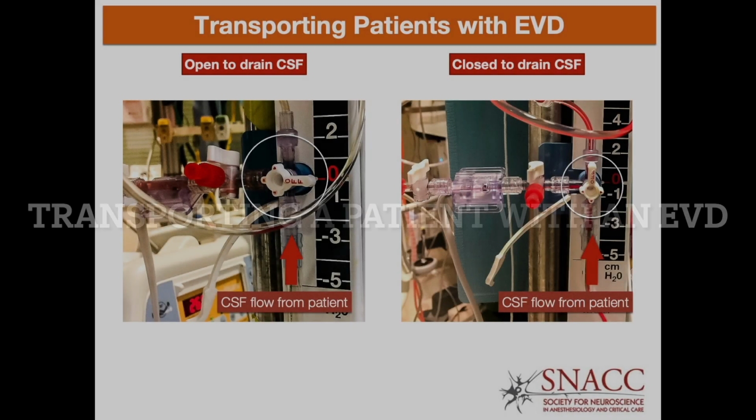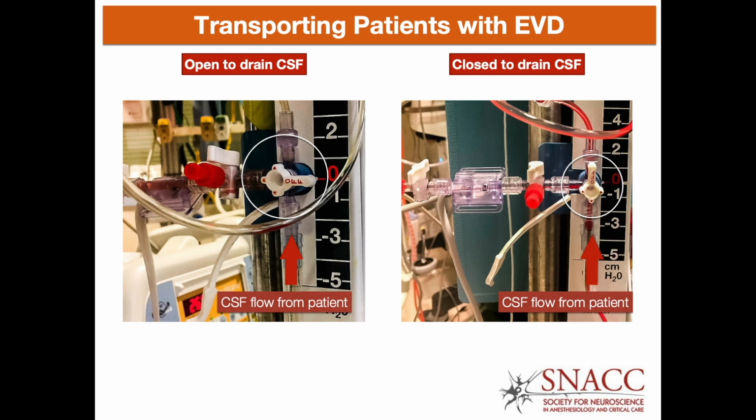We will now move to the safe transportation of a patient with an external ventricular drain. Patients with EVDs are often moved off of the ICU for imaging, angiography, and the operating room. So it's important to know how to safely transport these patients, as it often comes up. Let's quickly review the 2 positions of the stopcock.